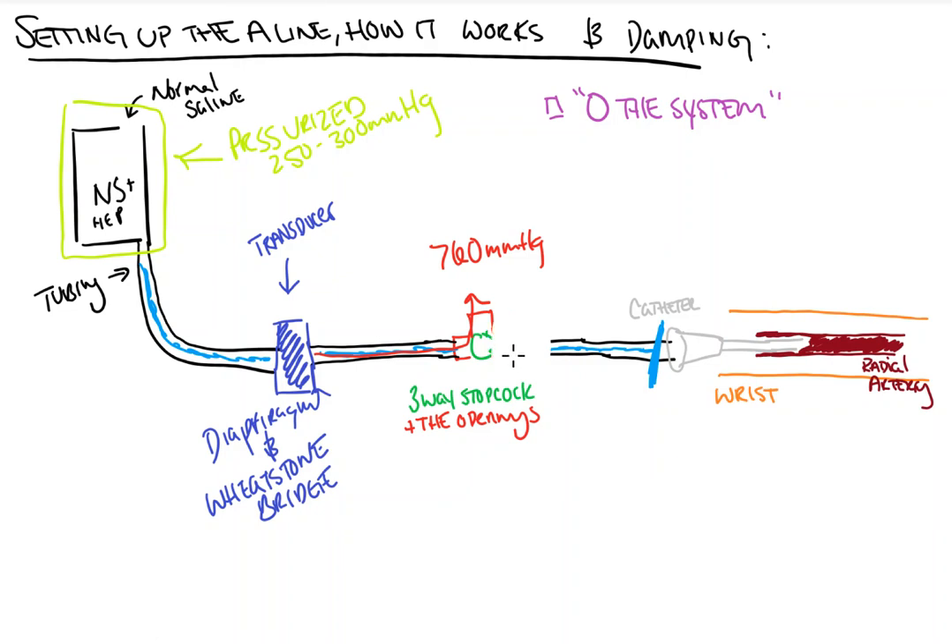So now we're ready to start transducing. We're going to turn our stopcock back up towards the air, and allow the blood pressure transducer and the entire line to be opened up to the patient. So now the entire system is opened up to the patient, and the transducer and system are exposed to the pressure wave generated in the radial artery, which will then propagate into the liquid medium up to the transducer. Once it makes contact with the transducer, it bends the diaphragm, which changes the resistance and as a result changes the electrical output.